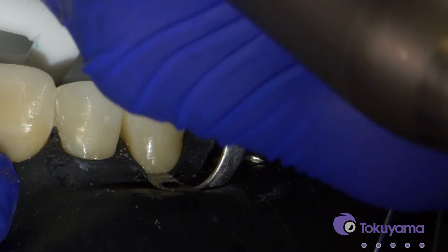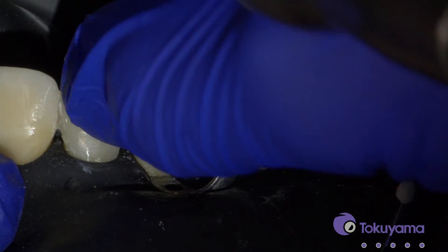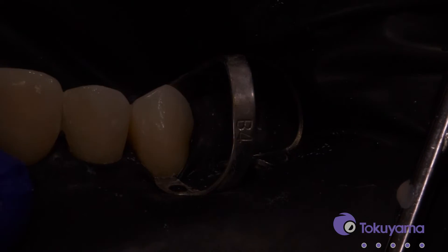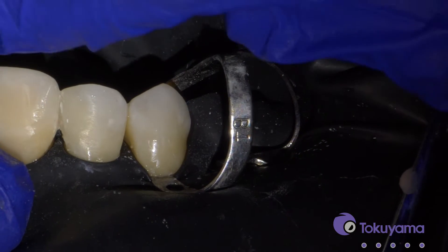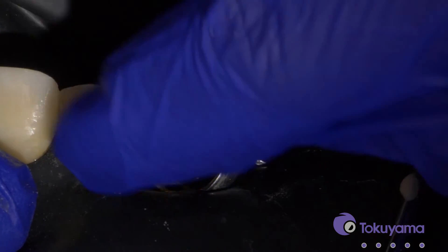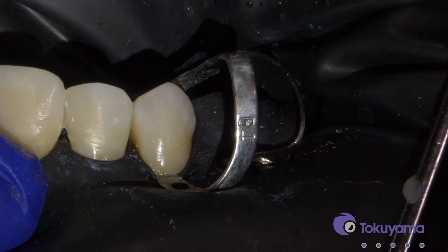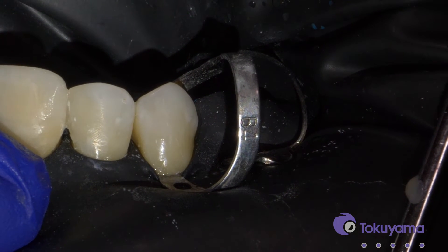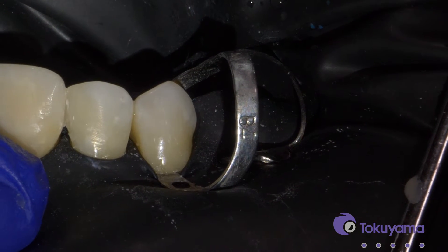So I was hoping I would actually get a void here — I've got a little void here that I can show you how to fix — so we'll just fix that really fast. What I'm going to do is drill a little bit of that out with a round burr, then we'll put the bonding agent again, and then we can put a little bit of the Omni-Chroma Flow. Even if you've done a lot of layering there, it's really nice with the Omni-Chroma because it's going to match to whatever you have. That makes it easy.